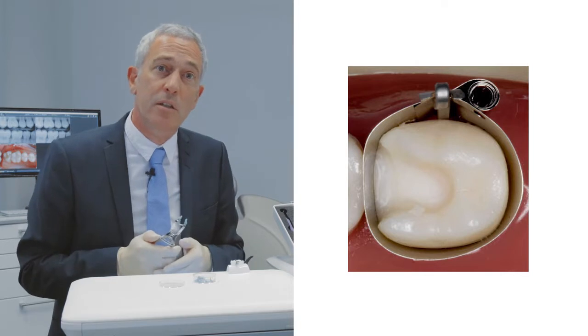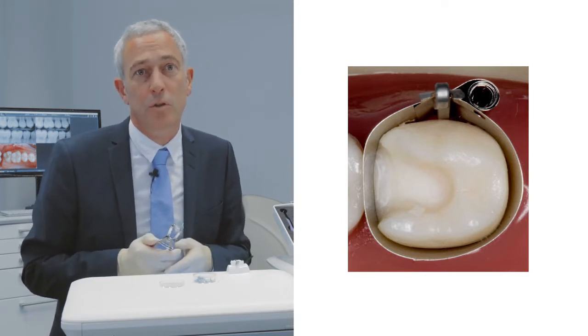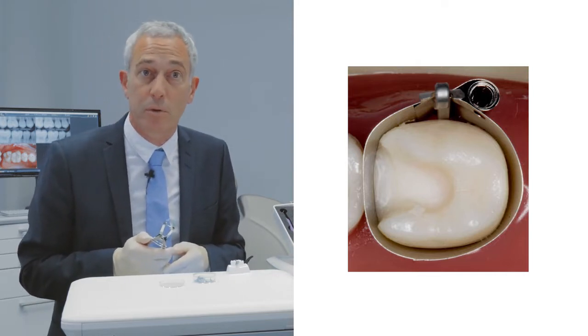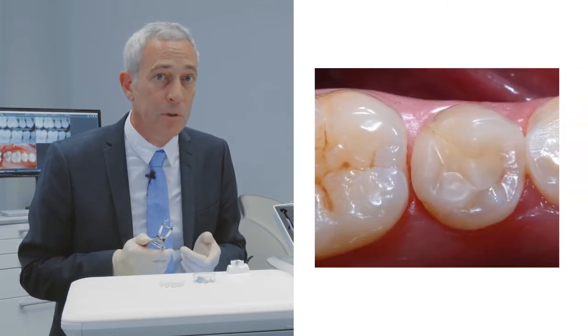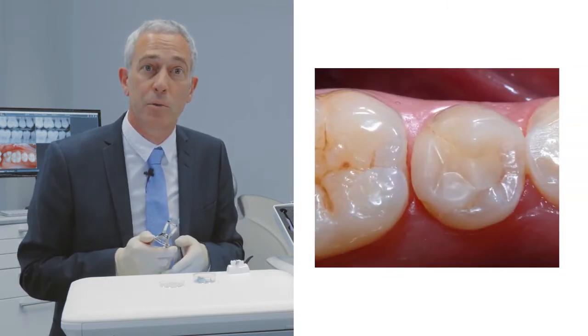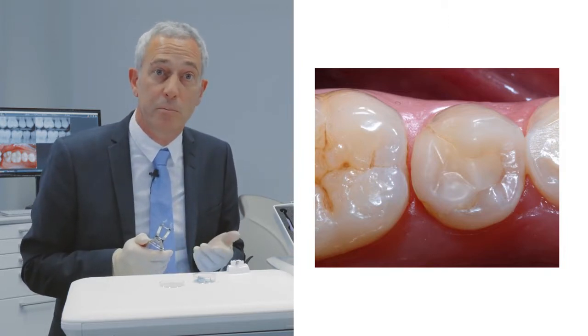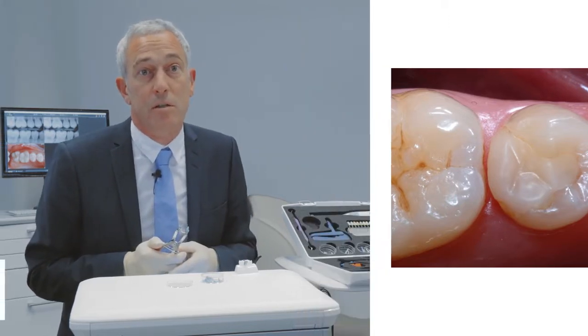Usually, each tooth is in contact with 1 or 2 neighboring teeth, and an important goal for long-lasting Class 2 restorations is to restore those contact points properly. Without a proper contact point, the patient will suffer from food impaction and the restoration can fracture, which can lead to periodontal inflammation, bone loss, or recurrent caries.